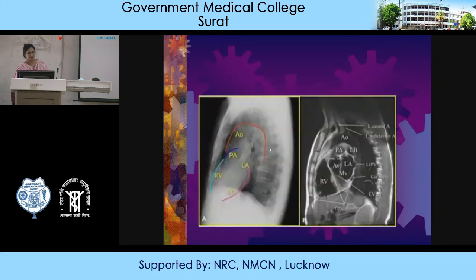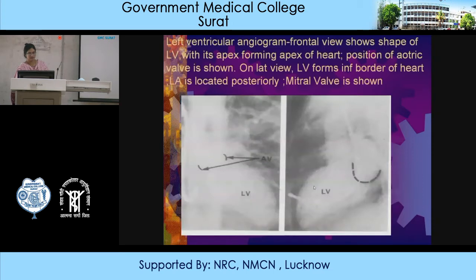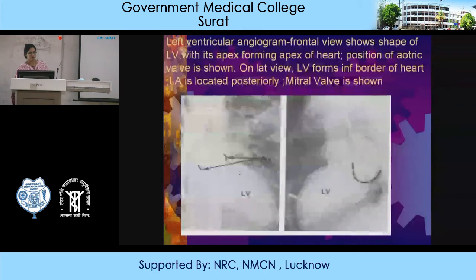CT images show the right ventricle, left ventricle, left atrium, pulmonary artery, and aorta, allowing easy delineation of these structures. On the left ventricular angiogram in the frontal view, the shape of the left ventricle is shown, the apex forms the cardiac apex, and the position of the aortic valve is demonstrated — the aorta arises from here. On the lateral view, the left ventricle forms the inferior border of the heart.